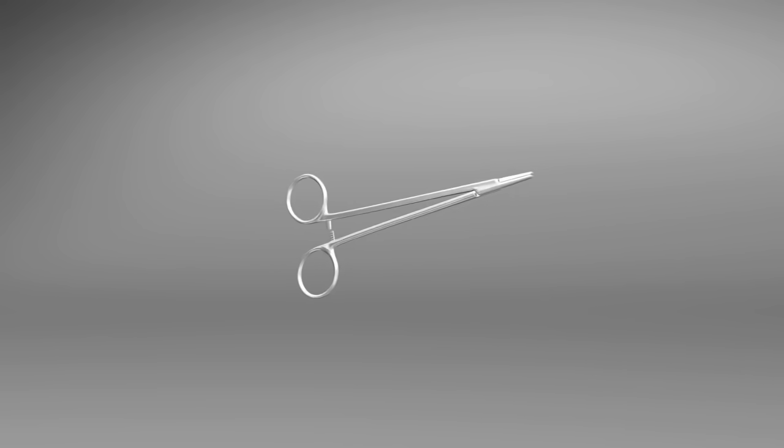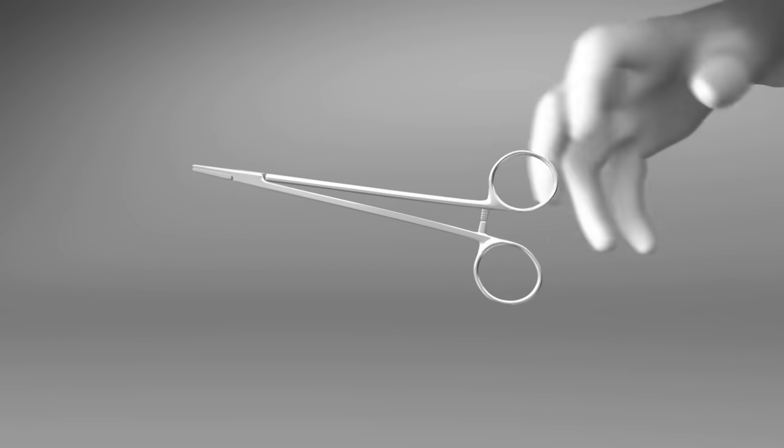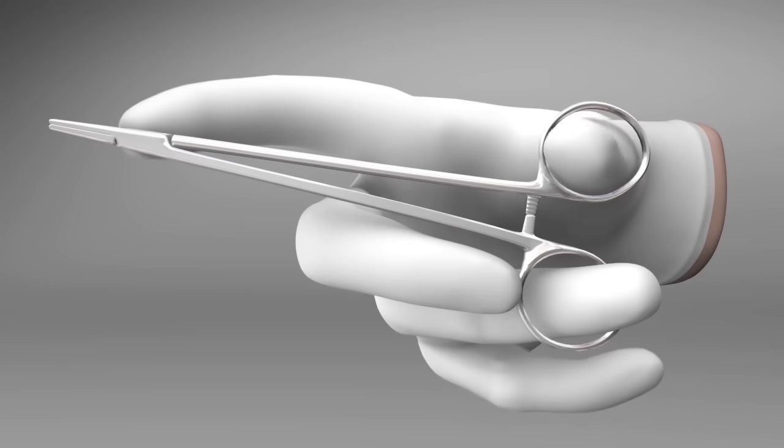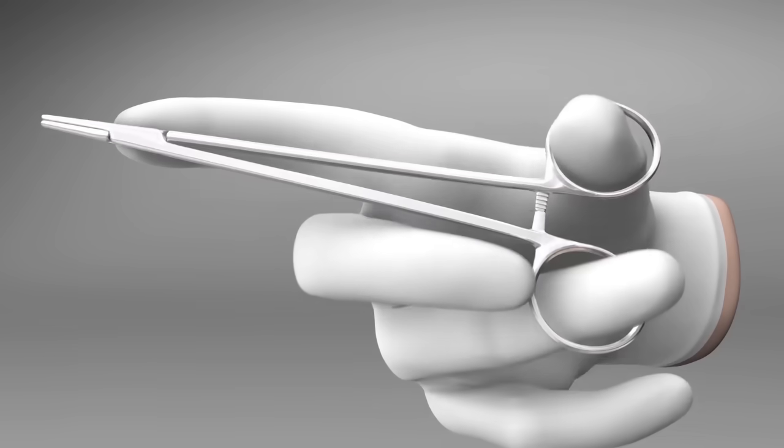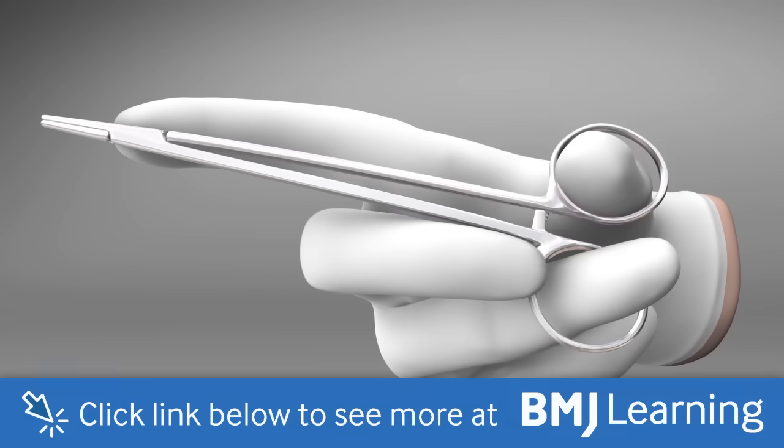Hold the needle holder correctly with the ring finger and thumb in the finger holes, the middle finger supporting the instrument and the index finger giving stability at the joint.